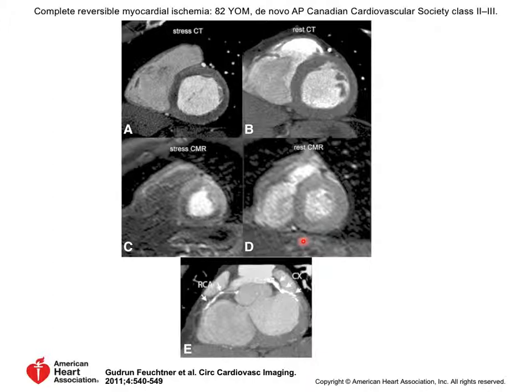But again, the whole stress test procedure itself isn't perfect. Right? That's why combining the stress test procedure with CT, in which you have a very high-resolution picture of the coronary arteries as well as this change in intensity, should be more specific, right? More sensitive and more specific.